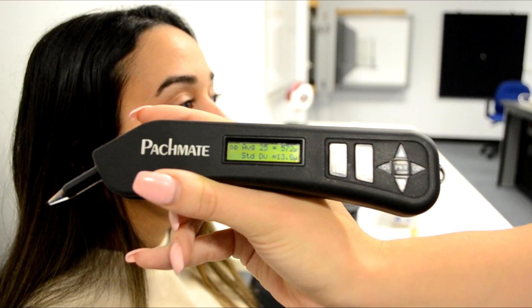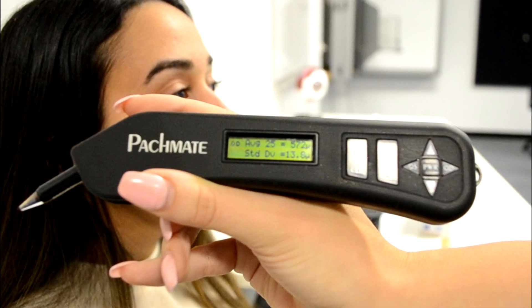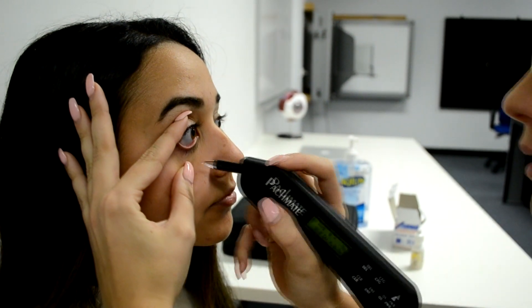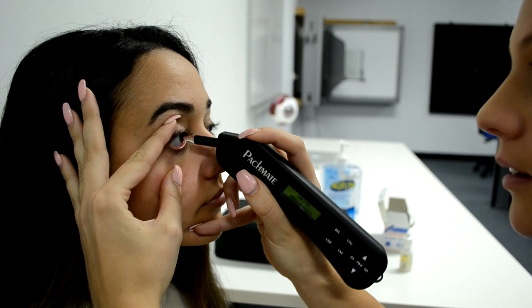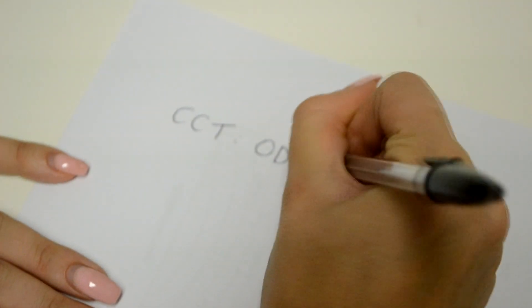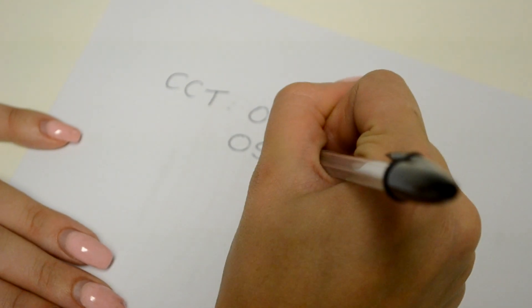The pachymeter will take 25 separate measurements and will average them. This average will be shown on the display along with the standard deviation. The pachymeter will then prompt you to measure the left eye. If you are not aplanating correctly or are in the wrong position on the cornea for three seconds, you will hear a long beep. You will need to take the probe off the patient's eye and adjust your position — the display will indicate poor aplanation. Record your results ensuring that you write CCT and your measurements in microns, and remember to indicate which eye the measurement is for.